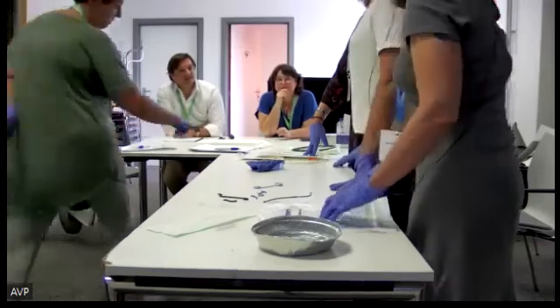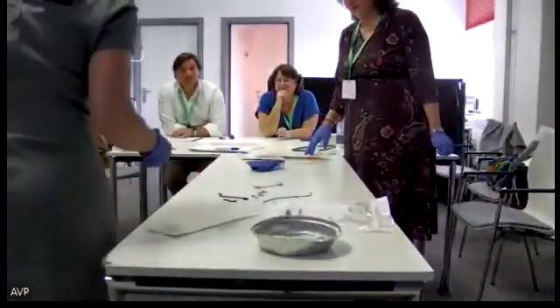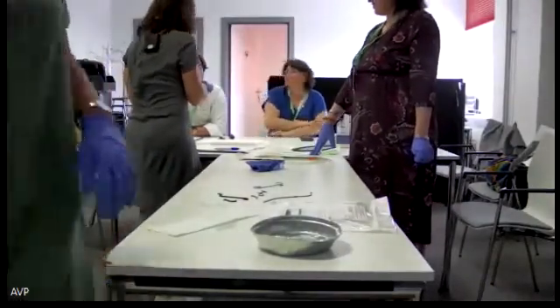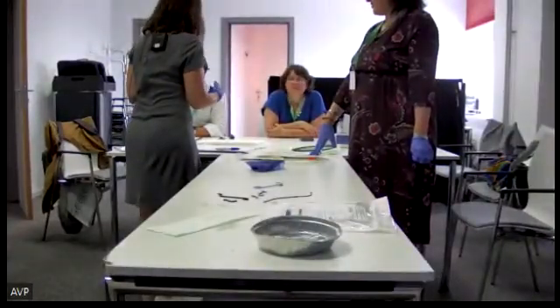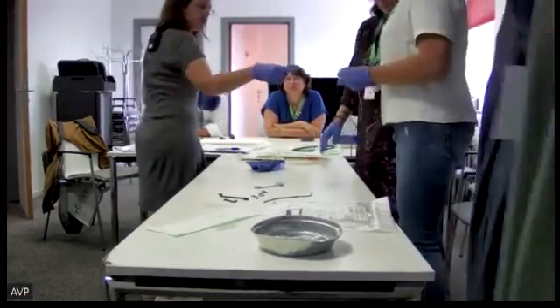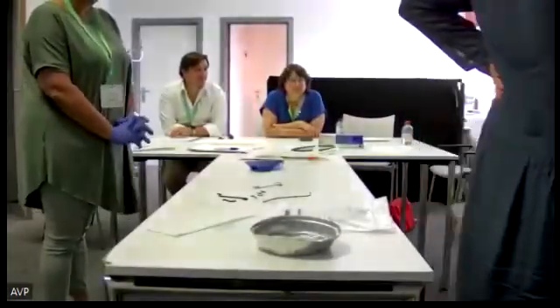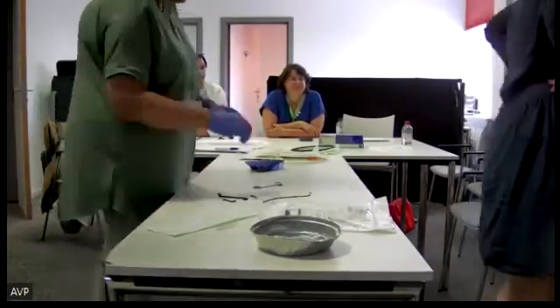FNA, FNB. FNA is mostly used for cytology, for cells, but also to aspirate liquids. The design of the FNB needles is such that they give more tissue. Maybe we can show it here. We have needles. For the FNB, what have we here? Well, this is the FNA, I think. Okay, I'll show the FNA here.